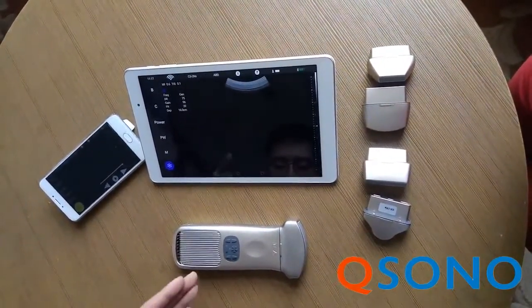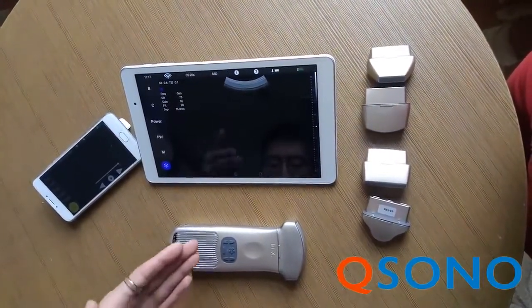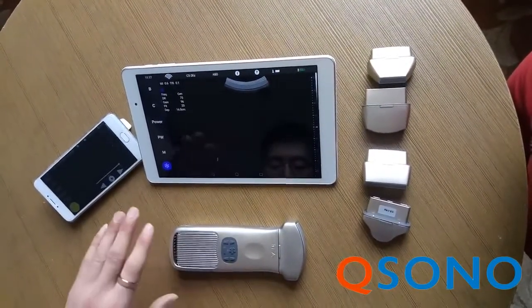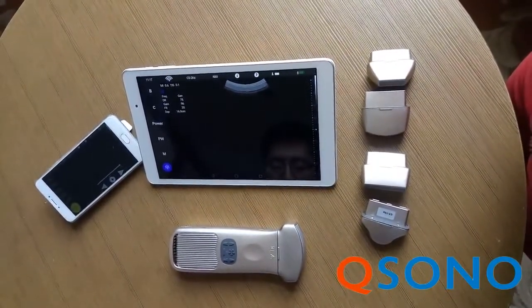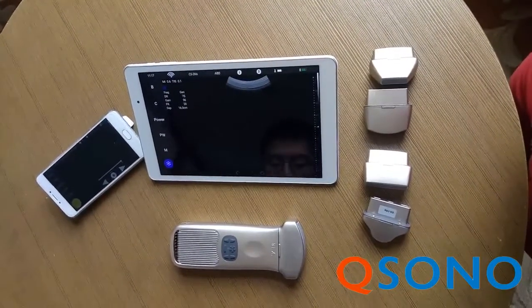This wireless pocket ultrasound system is a game-changer to the market, never compromising on image quality. It provides high-resolution ultrasound images as a wireless ultrasound machine, aiming at taking over the market of general point-of-care ultrasound with Wi-Fi.